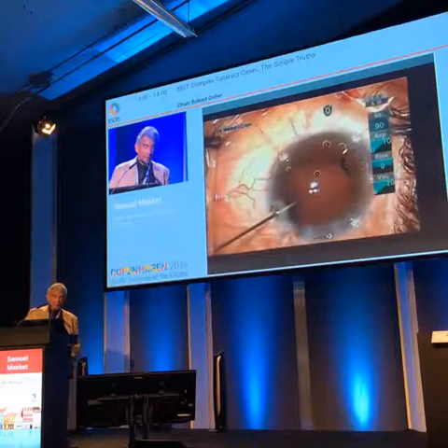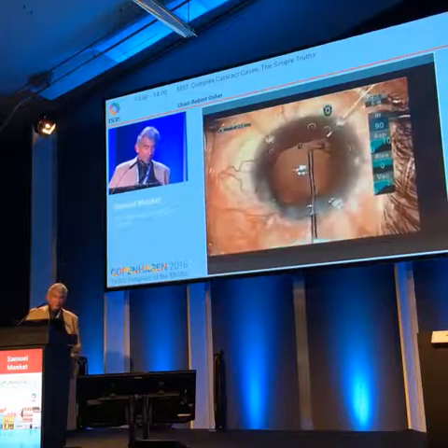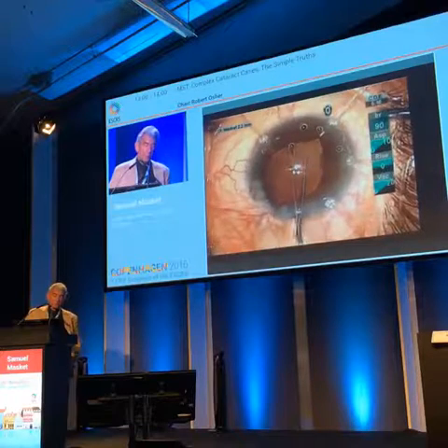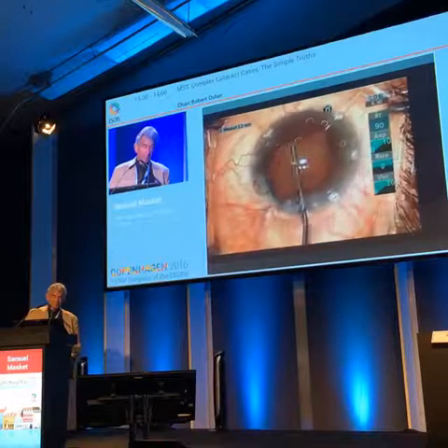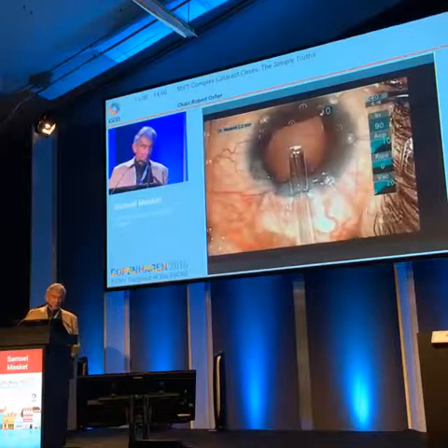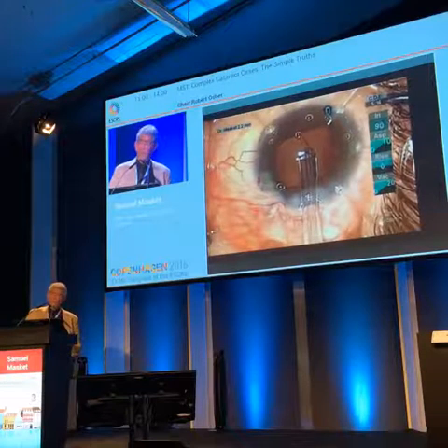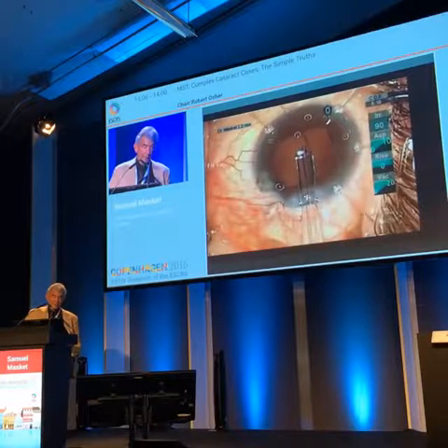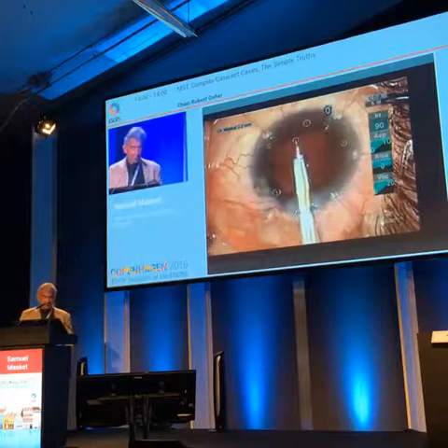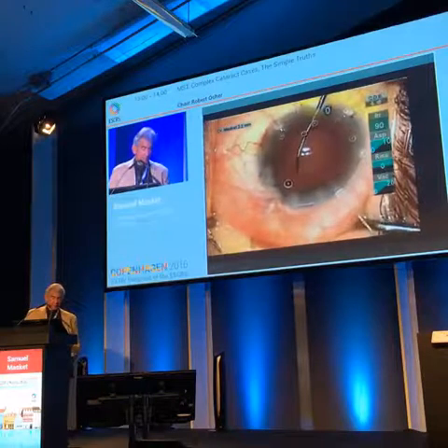As we come out, always in a case like this, we put in OVD, and again, we'll extensively clean LECs so that we can prevent postoperative capsule contraction. And it's good to be able to see what you're doing, so the iris hooks are helpful here. Given that I was going to plan to sew the iris and create a centralized pupil for the patient, I thought best long-term to place an endocapsular tension ring, and so that was done.